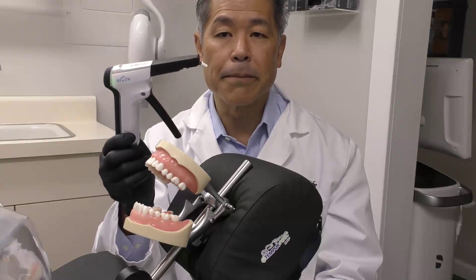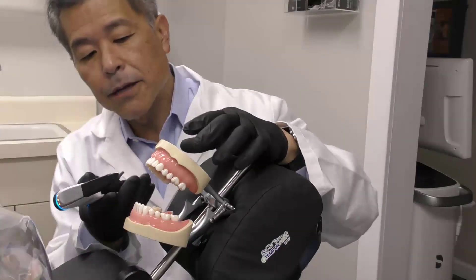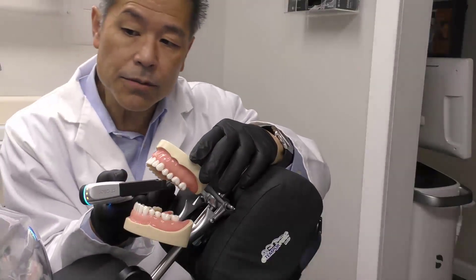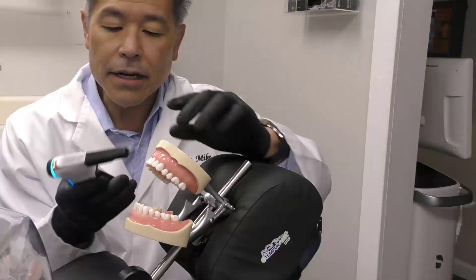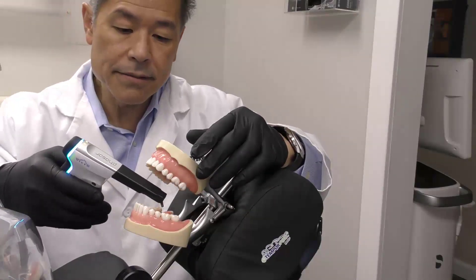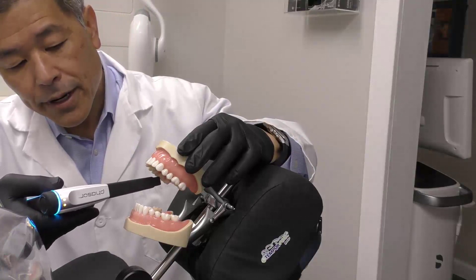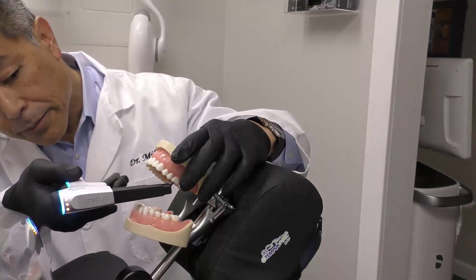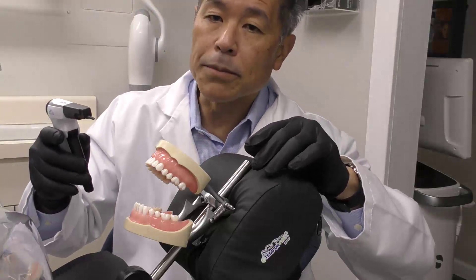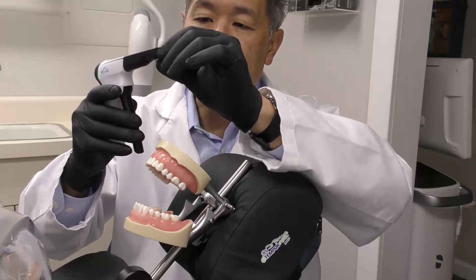In about 45 seconds, we're going to have our composite in the compules set and ready to go. The Phaser is able to get to all corners of the mouth — I'll show how you can get up to the upper right tooth right in there. You can get to all areas of the mouth, and although we don't have cheeks here, you can clinically get into all the different areas. There are also step-down tips, which I'll show you — you screw that onto the compules.